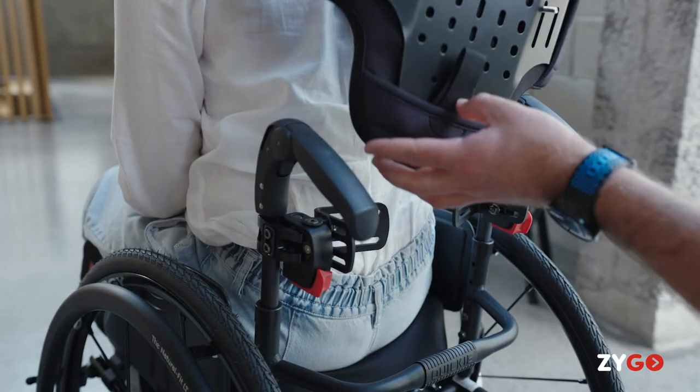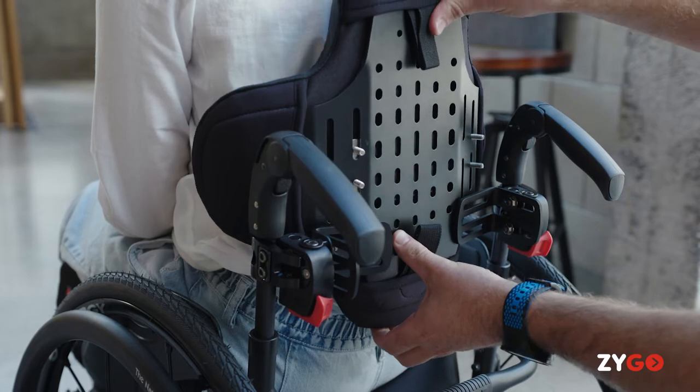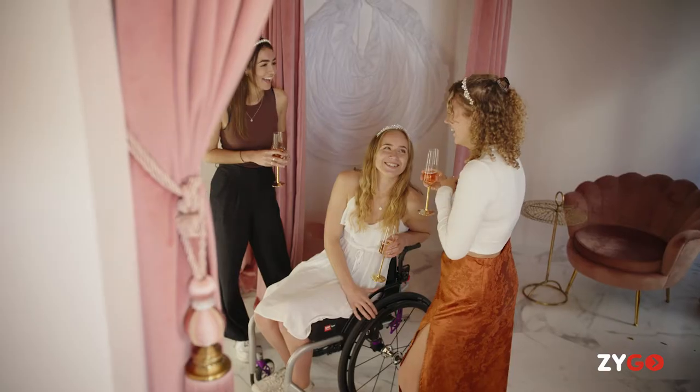The Zygo is designed to be really easy to adjust, to take on and off, and truly adjustable to the client. It's lightweight, it's breathable, and it's really configurable to each individual user.